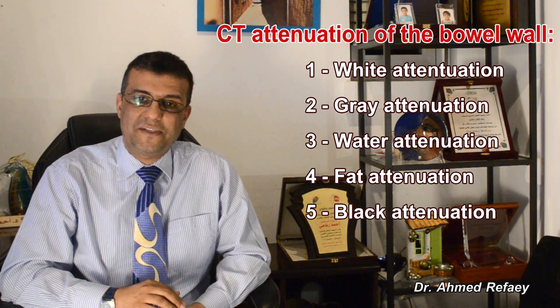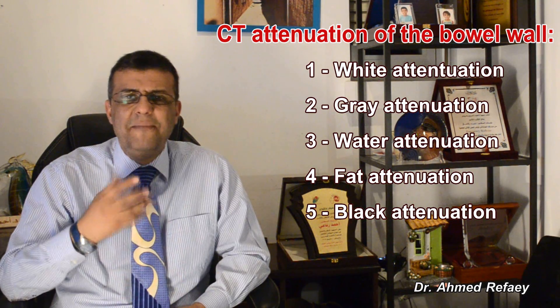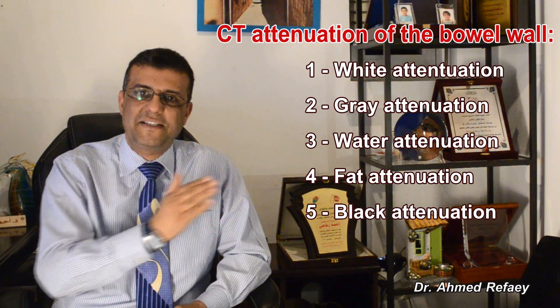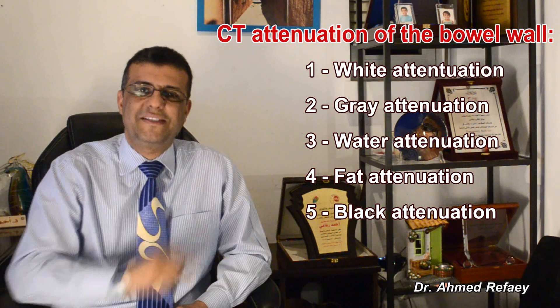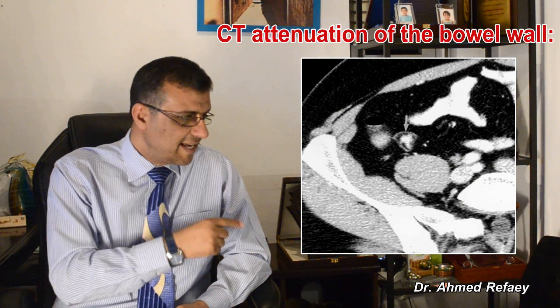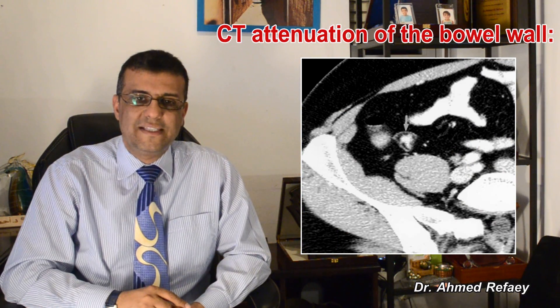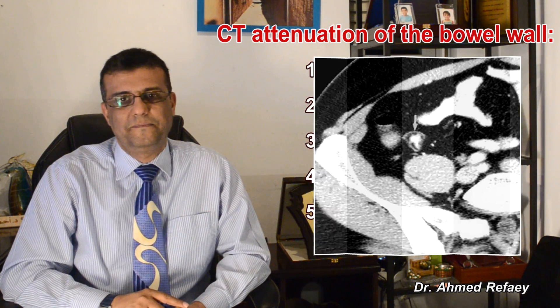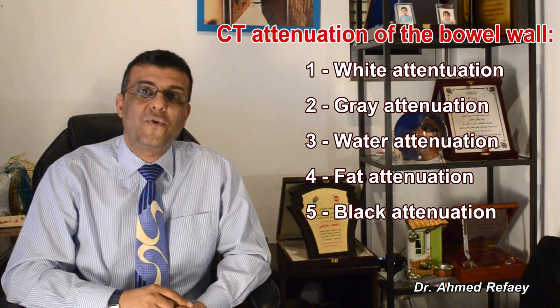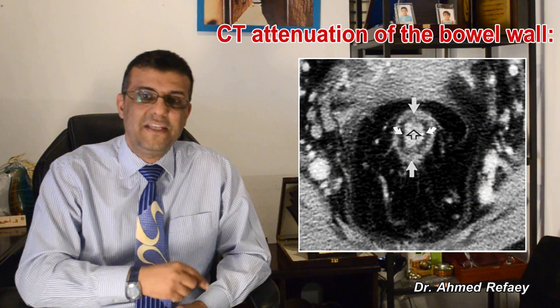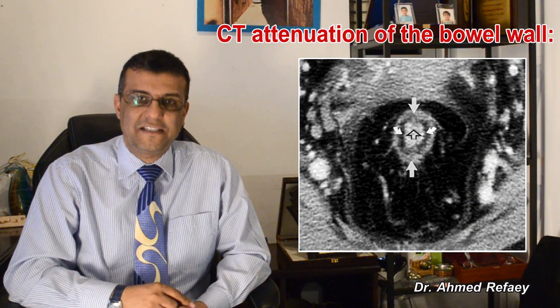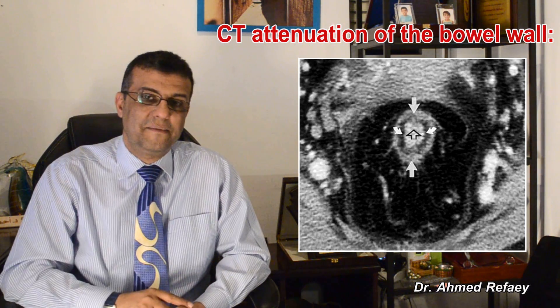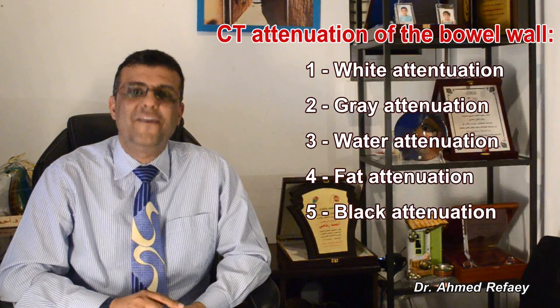The fourth category is fat attenuation, where there is fat replacement seen in the submucosa. Here we have a limited differential diagnosis: either chronic ulcerative colitis or chronic Crohn's disease. This is a case of chronic Crohn's disease showing fat replacement in the region of the terminal ileum. Another example is chronic ulcerative colitis, showing fat replacement in the submucosa involving the rectum.